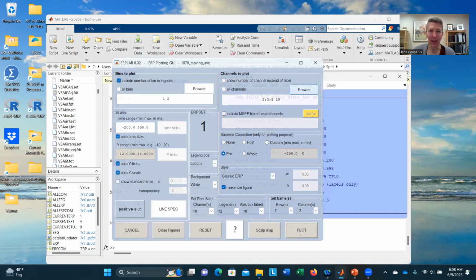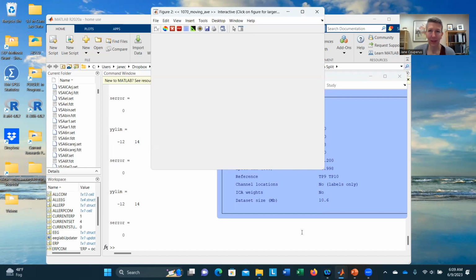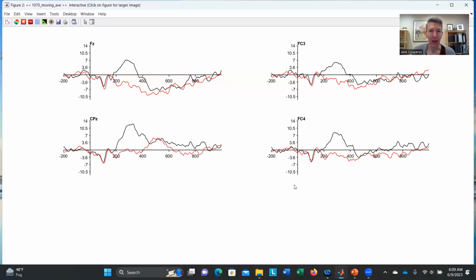So I'm going to go ahead and hit plot. And it's going to pull up my waveforms. And so then I can compare these waveforms to another average where I haven't rejected as many. In this case, this was the one where we rejected a lot of trials. But what about if I hadn't have done so? I could compare those and say, well, which ones look better? And at first, things looking better may not mean much to you, but after you've looked at a lot of these things, it will become more apparent what you're looking for.